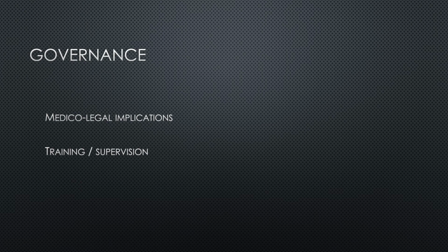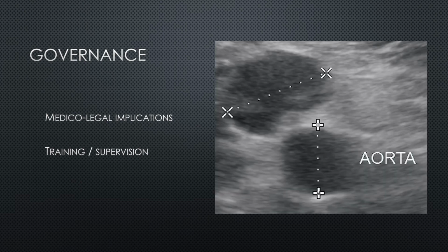However, in the group of suspected PE, especially if they're too unstable to go around for any formal imaging, I think being able to do a reasonably accurate 2-point compression DVT scan really adds a lot. Also a word on incidental findings.